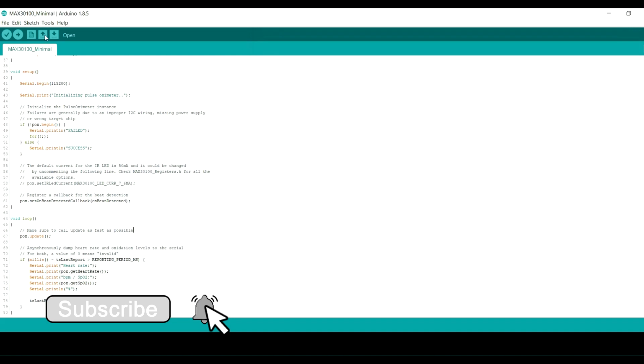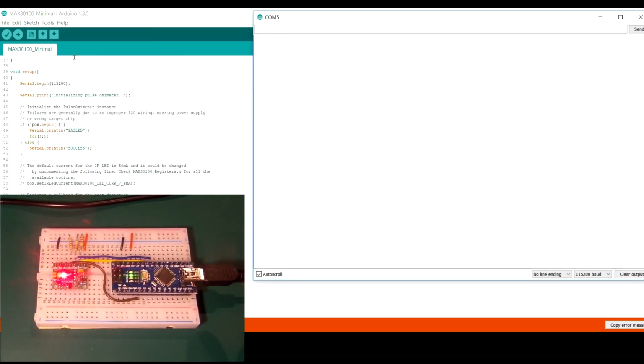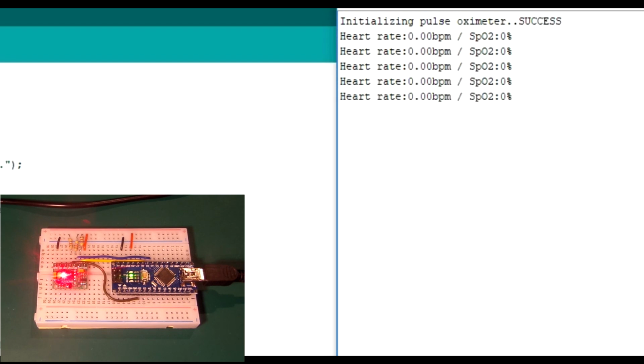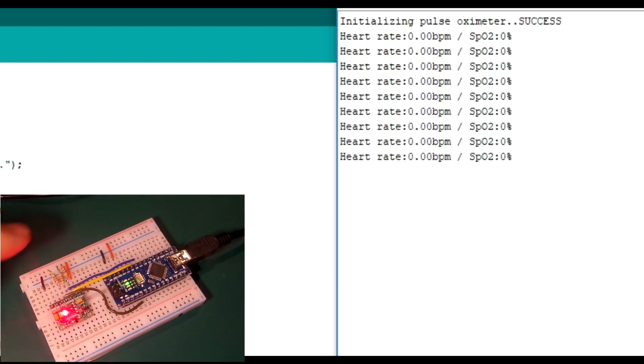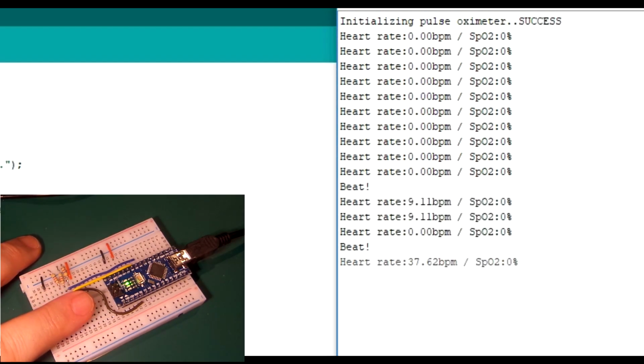Oh, so you need your serial monitor open. So go to tools and serial monitor. There we go. So it's initializing it. And then it's got heart rate, and because I've not got my finger on it, it's got a heart rate of zero and my blood oxygen level of zero as well. So I'm just going to pop a finger on it. Let's just face it like that and put my finger on it. And just let it settle down.